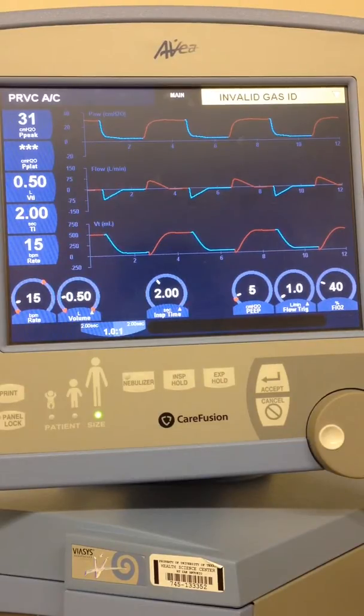In the PRVC AC mode, the question is, will the tidal volume change if we change our inspiratory time? Because we're changing our inspiratory time to a lesser inspiratory time, we're changing to a 1:4 ratio, we are changing the flow. We're allowing a shorter amount of time for the air to get into the lungs, so that makes the flow have to increase in order to achieve that.